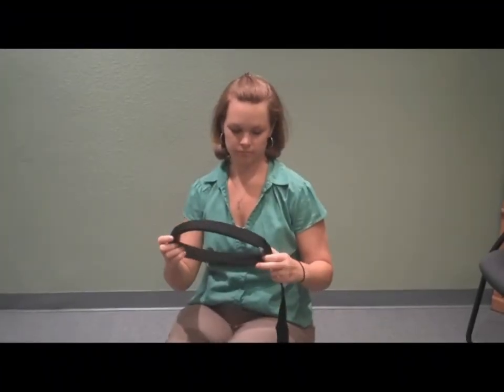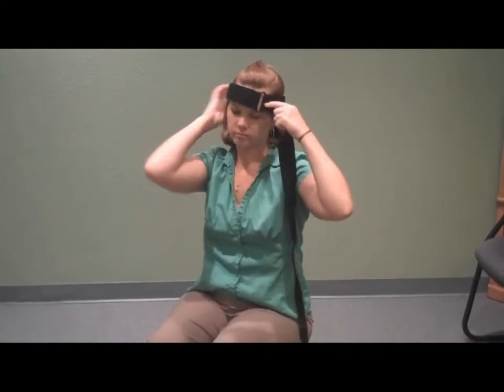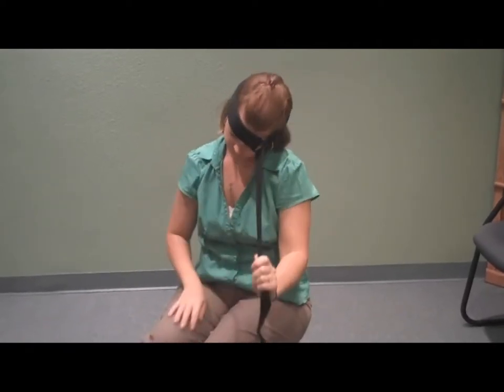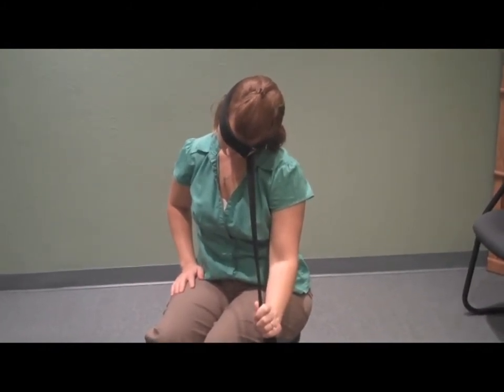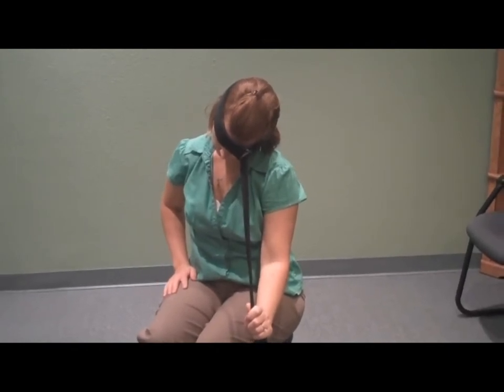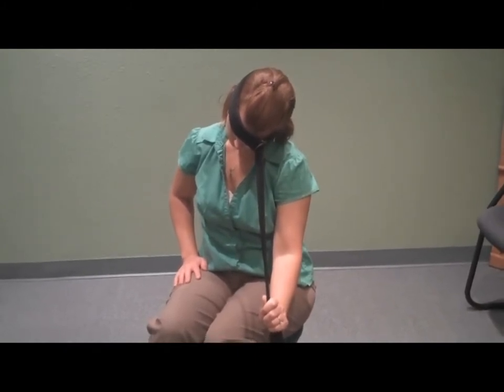Here we're demonstrating how to use the six-way strap. First, we're going to put it on our head right above the eye, and we're going to pull down at about 30 degrees in front — not directly to the side, just like she's doing there. The important key for this is to keep an erect posture with your back straight and just let all of the stretch happen in the neck as you pull it down.